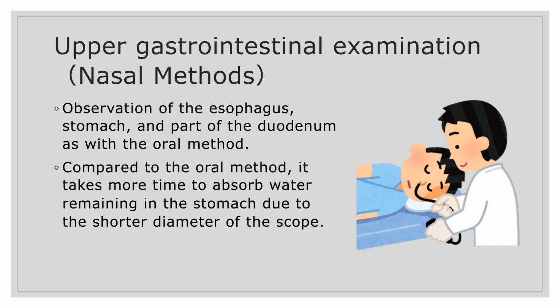The nasal method is not suitable for the use of instruments and devices that can be used with the oral method. For this reason, nasal scopes are often used mainly for examinations such as medical examinations. In addition, because the forceps opening is narrow, it takes time to suck out any remaining water in the stomach.